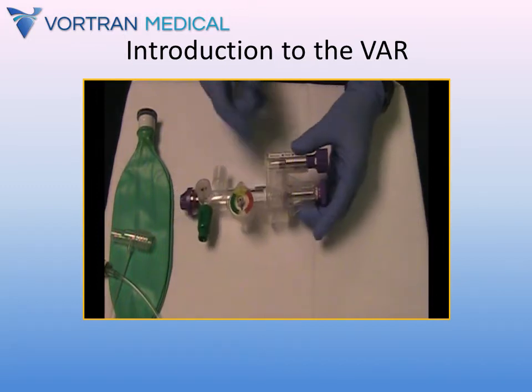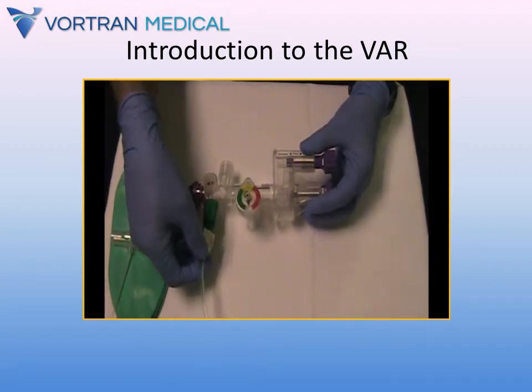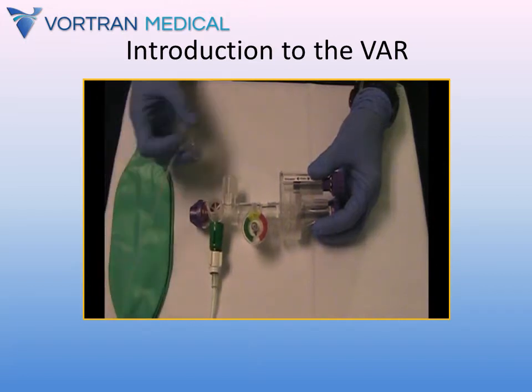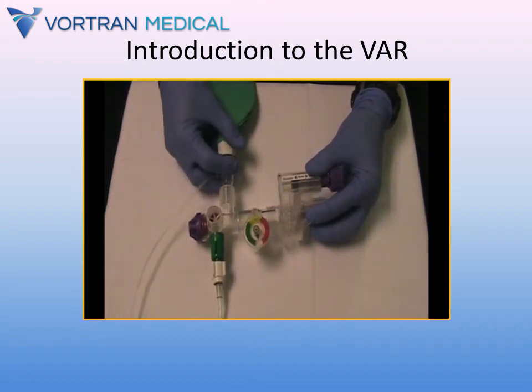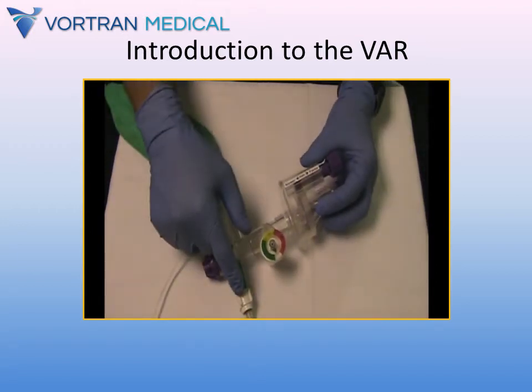So let me hook this up and I'll show you how this works. First, I'm going to take our oxygen supply tubing and attach it to the green port. And then I'm going to take an end-tidal CO2 filter line and attach that to where my patient would be. And then I'll put a test lung on top of that. And now I'm going to turn it on to 10 liters a minute.